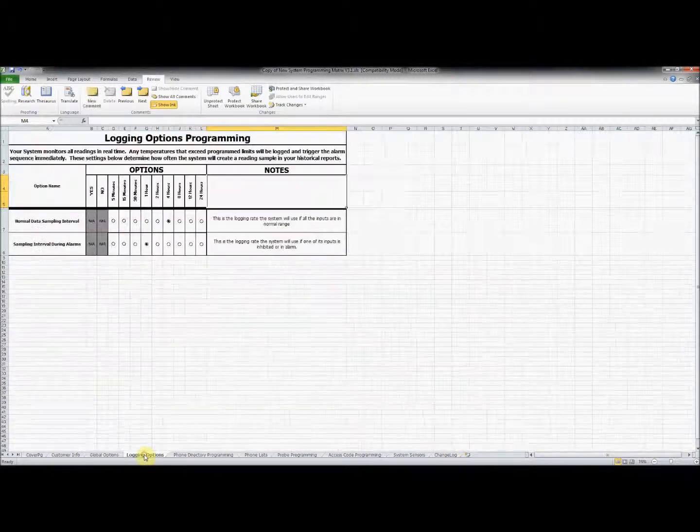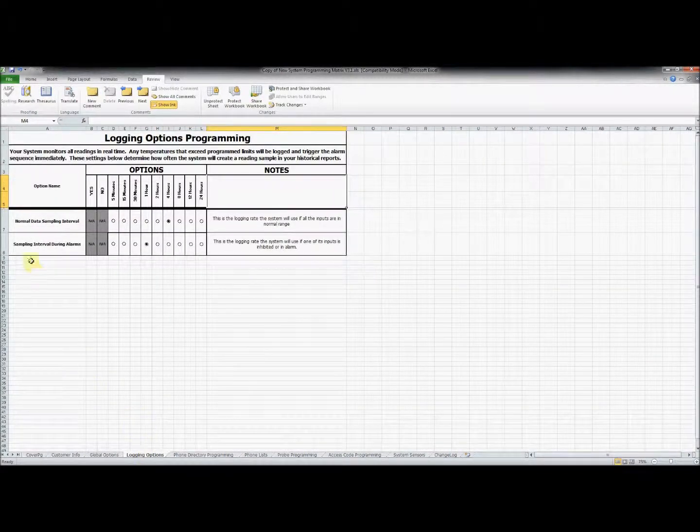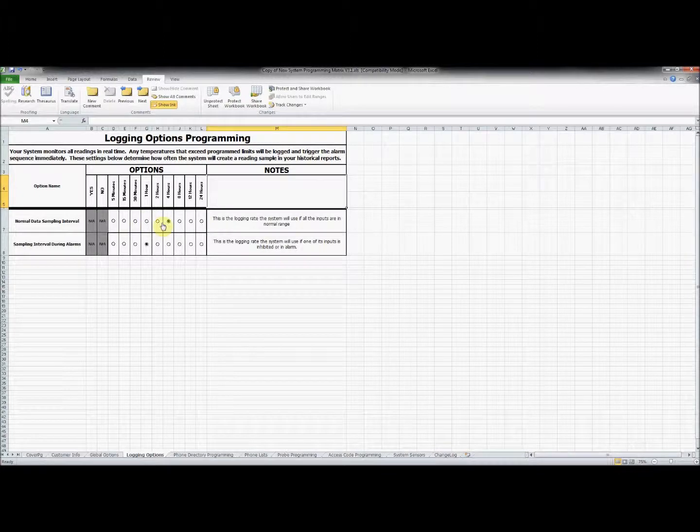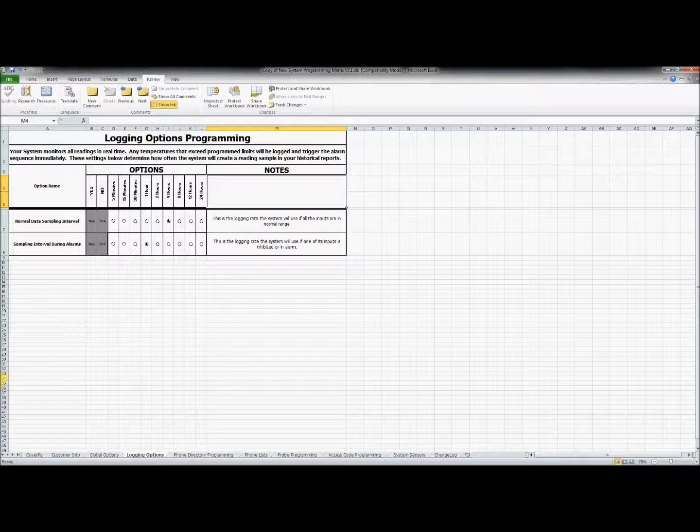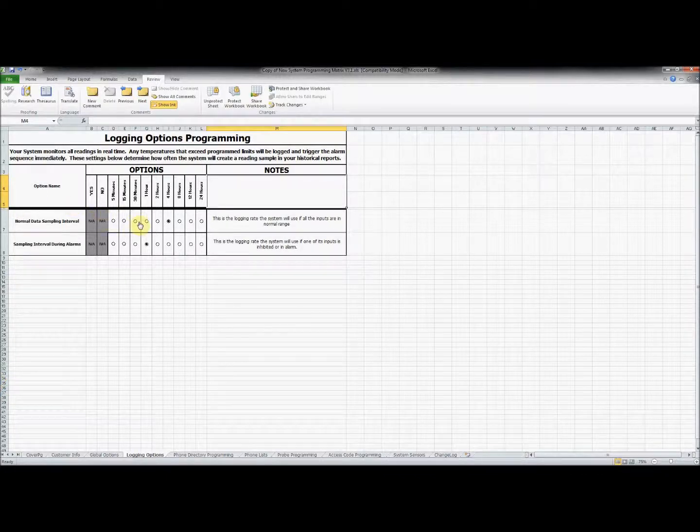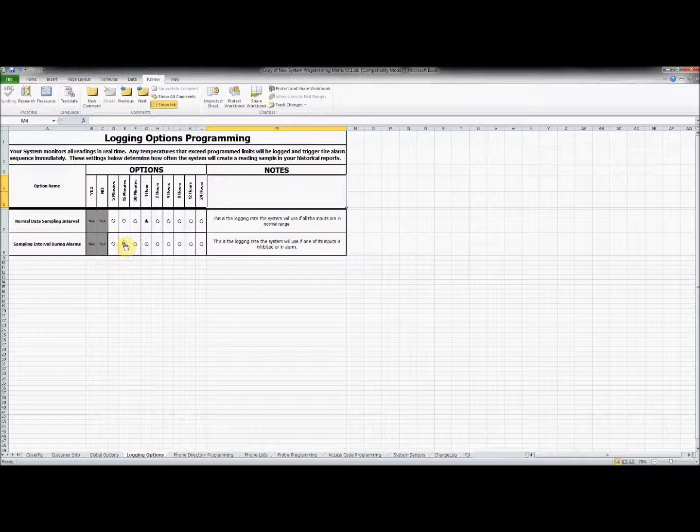The next section deals with programming logging options. You will notice that there are two sets of options to set. The first deals with the sampling interval for when the alarm is in normal range. The second option is for the time interval samples when the input is in alarm. These alarm ranges will be defined when we get to the probe programming tab.